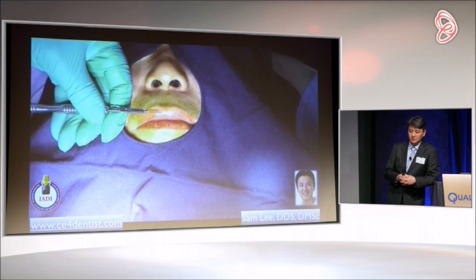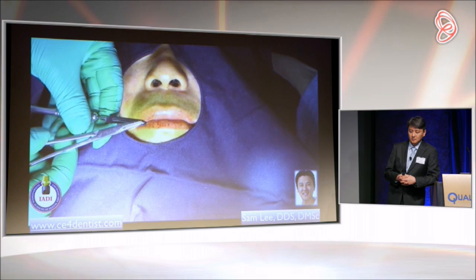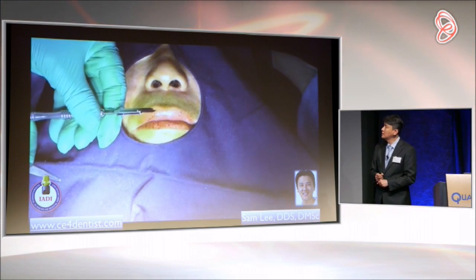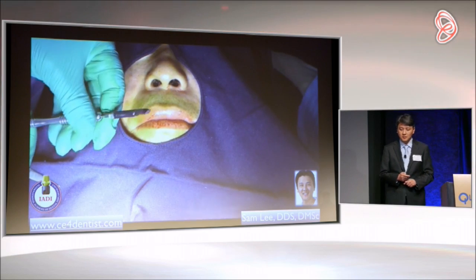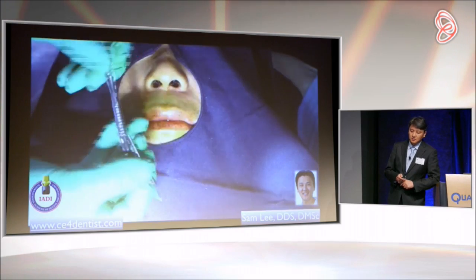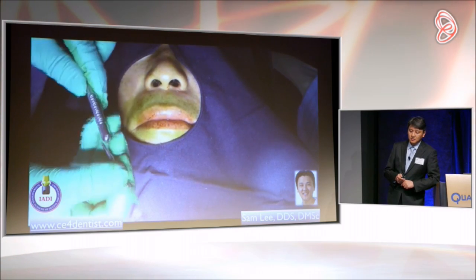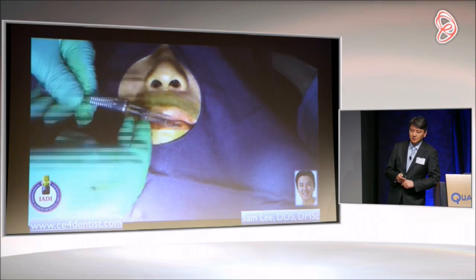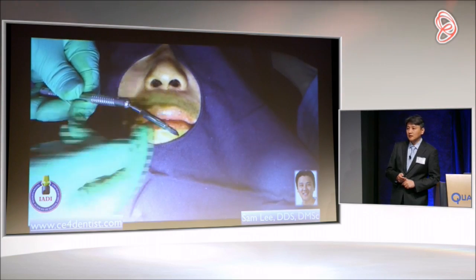The key about the double blade is that one height should be lower than the other, because the height of the palate is not parallel. So this is a double blade, and inside the mouth it is very important to be able to change the angulation as well, so that you can adapt your angulation.